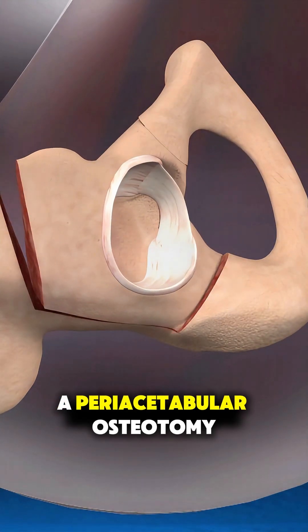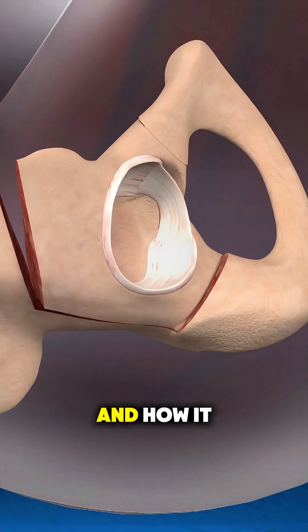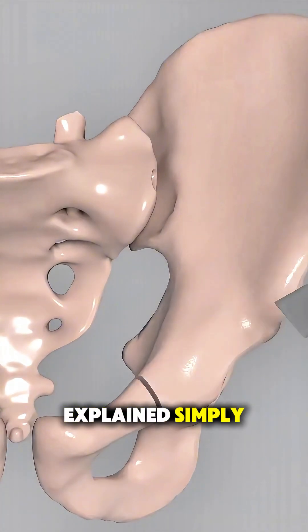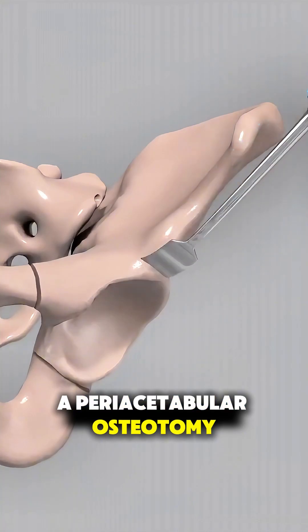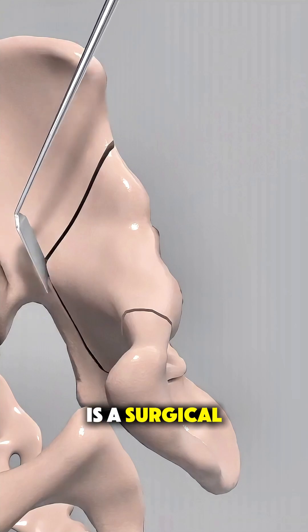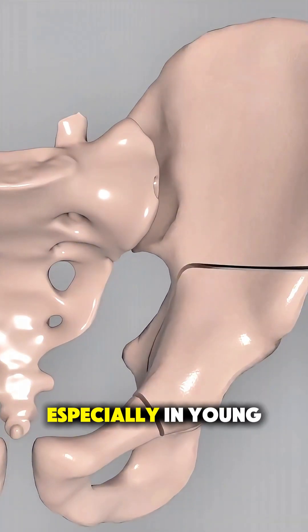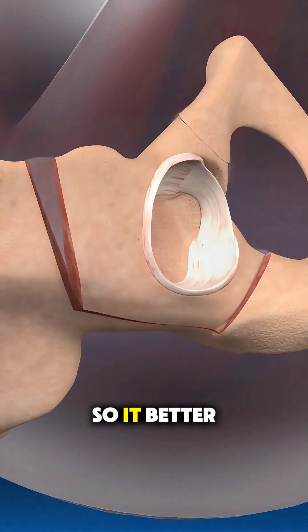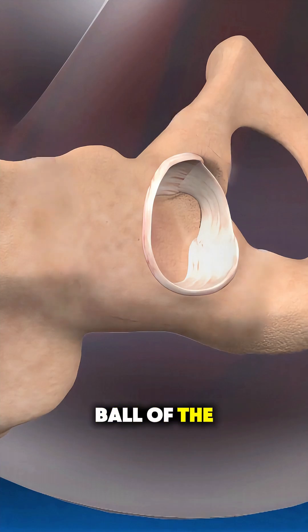Ever wonder how a periacetabular osteotomy is done and how it can save a damaged hip? A periacetabular osteotomy, often called PAO, is a surgical procedure used to treat hip dysplasia, especially in young adults. The goal is to realign the hip socket so it better covers and supports the ball of the hip joint.